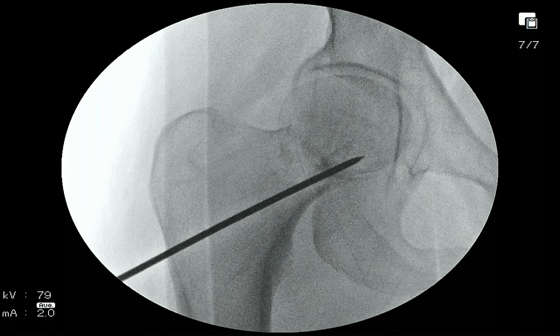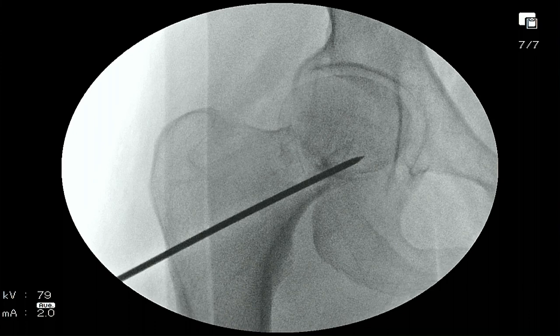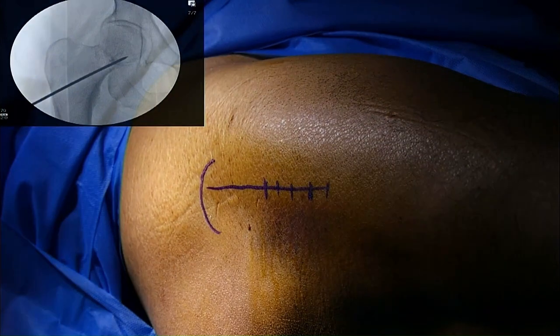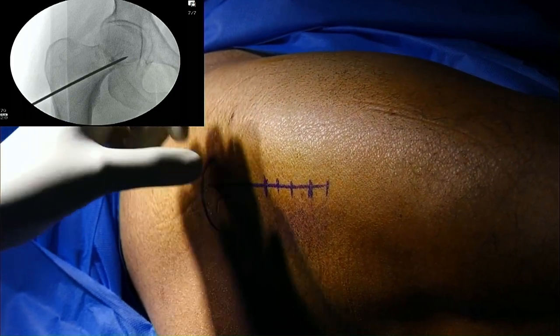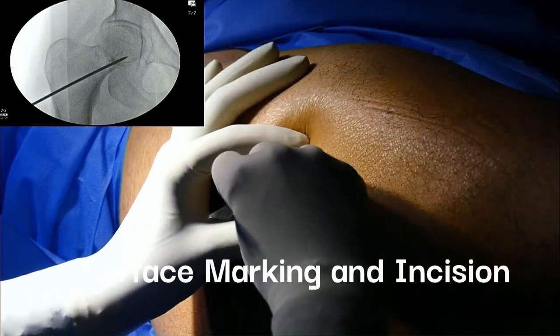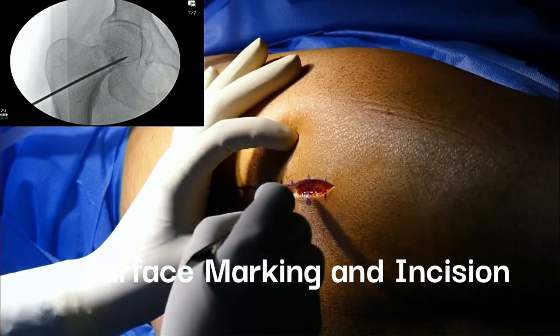Okay, so we start the next live surgery. I request Dr. Chailesh sir to moderate the session. This is a 57-year-old person with a sub-capital fracture neck femur, now about four days old. This is the tip of the trochanter I have marked — this is where approximately my guide wire will be. Two centimeter above, two centimeter below, I have just marked it, but I take the incision more on the inferior side because we have to go at an angle of about 130 to 135 degrees.